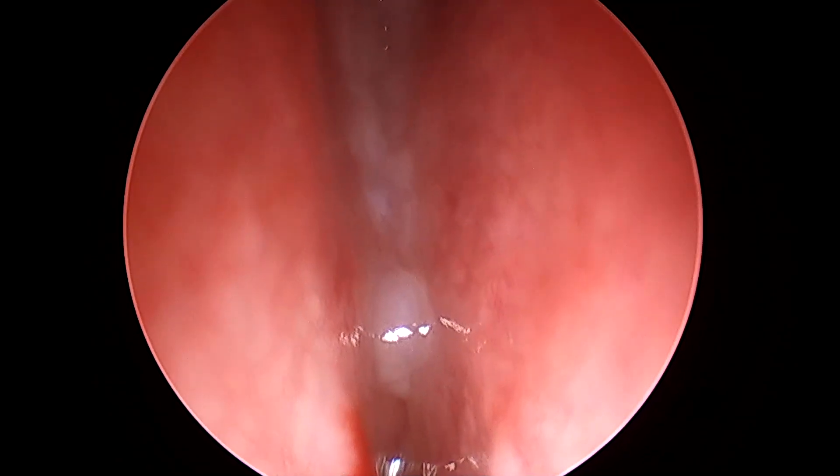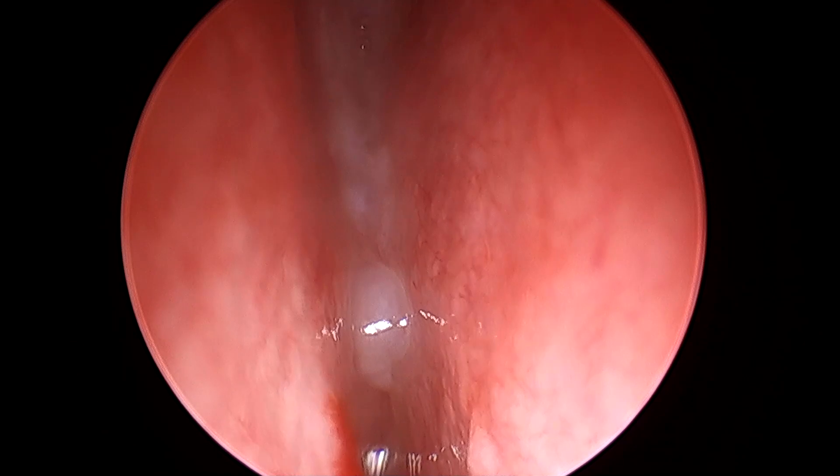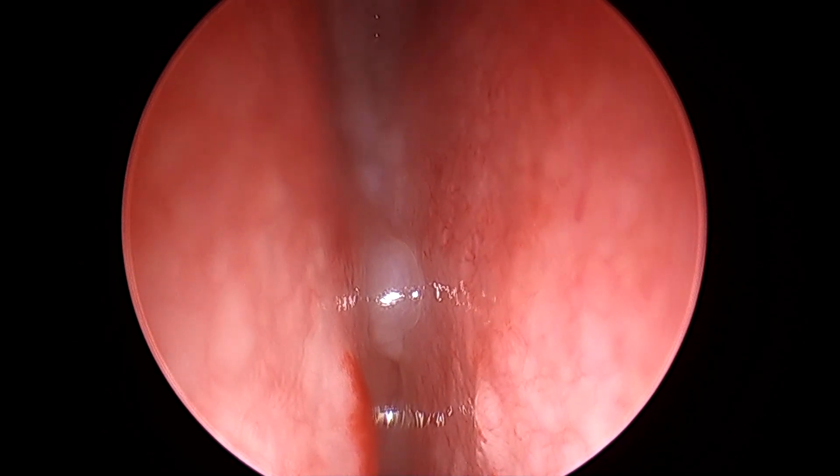This is how you basically do the nasal endoscopy in a patient with suspected CSF leak from the cribriform plate, which is the most common area for a CSF leak.